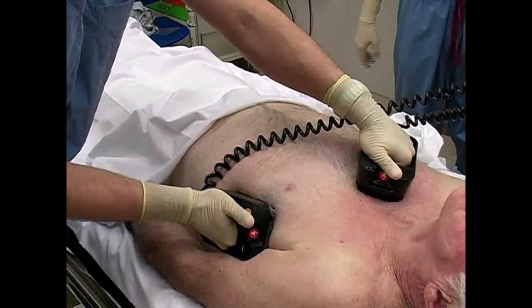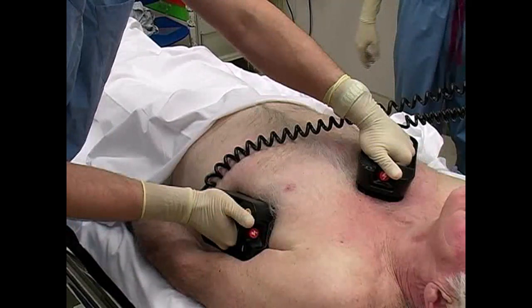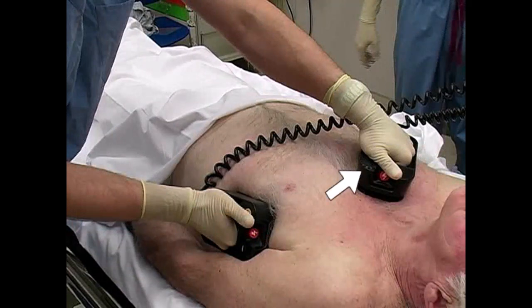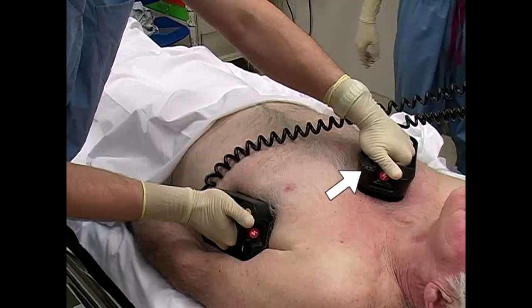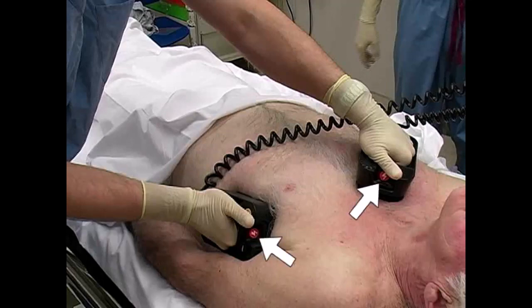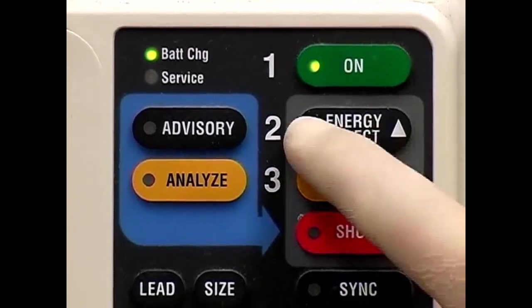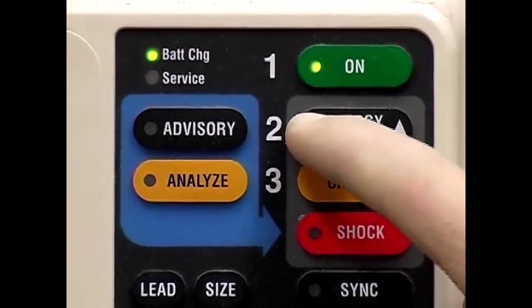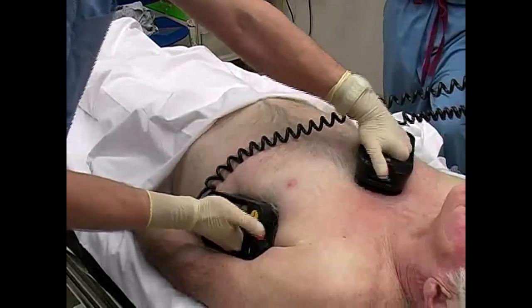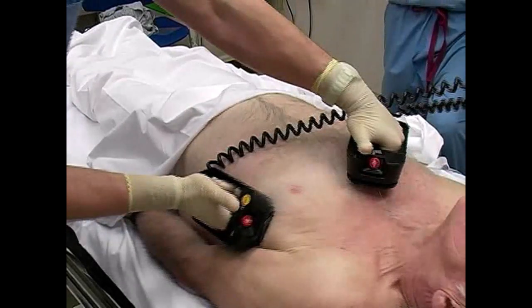To cardiovert, follow the same sequence as described in the previous section. Note that the Energy Select, Charge, and Shock buttons may be found on the paddles, or an assistant can push the buttons on the front panel of the machine. To discharge the energy, push the shock buttons on both paddles simultaneously.